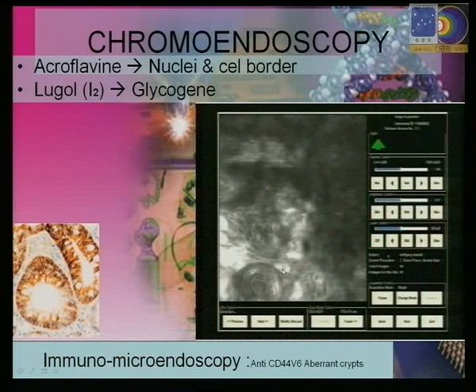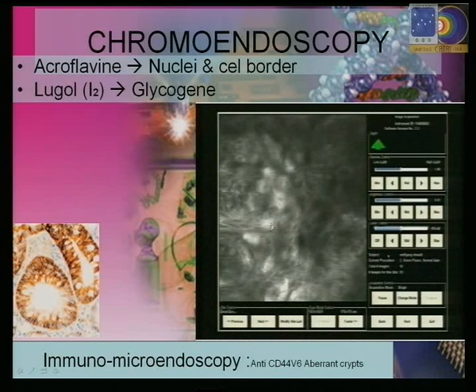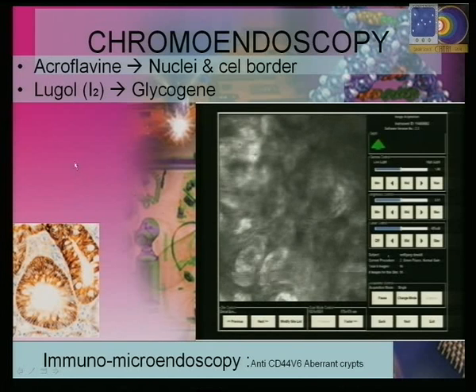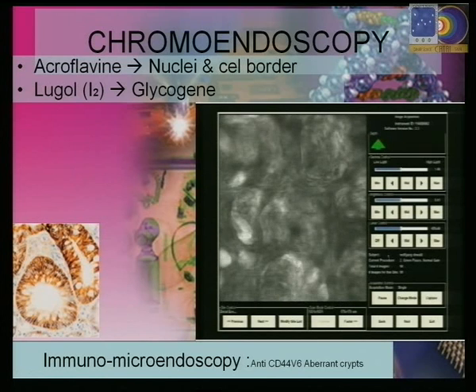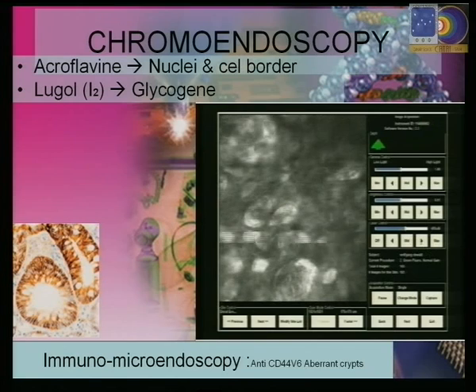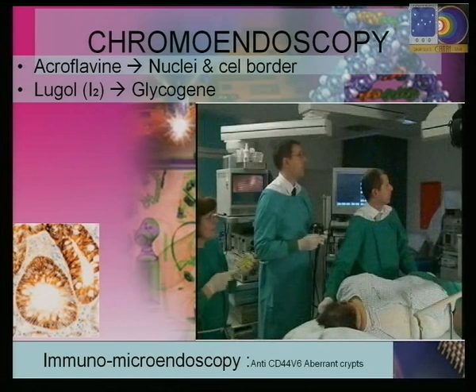Squamous epithelium is displayed as gray cells with low contrast. However, capillaries are brightly highlighted in the lamina propria. Here, irregular and twisted tumor vessels can be identified. Changes in vessel architecture are in real time, so that means that it's moving. It's not a very nice image as you have seen previously. Different depths can be imaged using additional buttons of the endoscope control body.